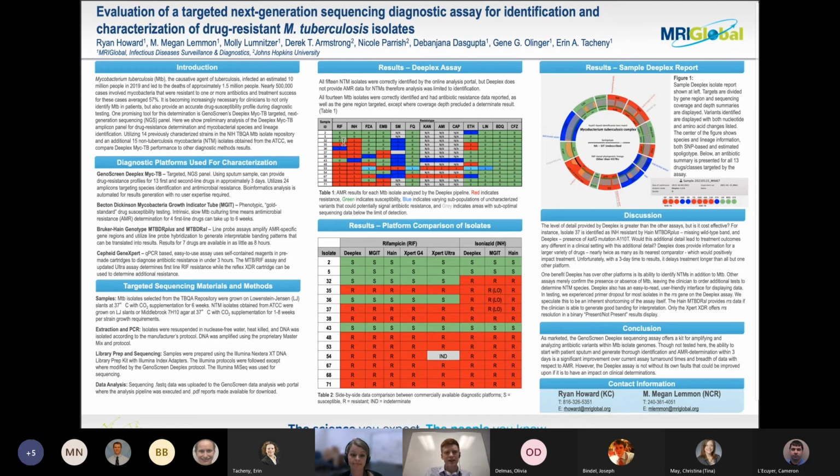What this assay does is we're looking specifically at antimicrobial resistance. So being able to know that if a patient comes in with tuberculosis, what is the best drug treatment regimen to give that patient? Because more and more we're seeing that people will come in and the traditional antibiotics like rifampin or isoniazid won't treat the patient. You can give them as much of the drug as you want, and it won't necessarily be effective against that particular isolate that the patient is infected with.